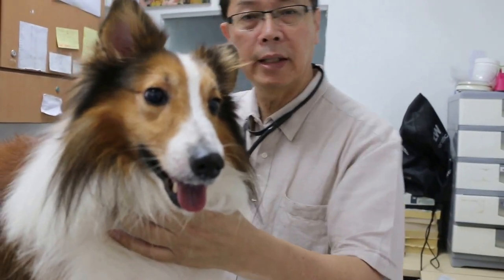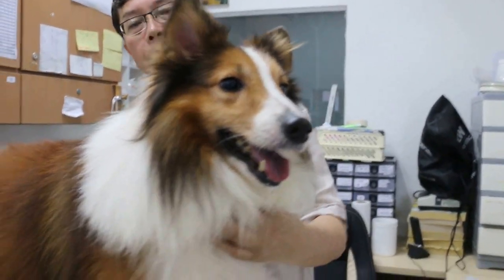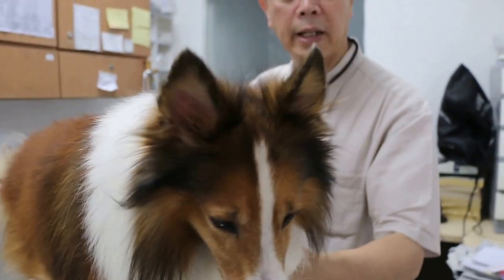Now, before doing anything, I weigh the dog so that I know the correct dose of the sedation drugs. Then after that, we take the rectal temperature. Rectal temperature is normal. So these are the two things to be done.